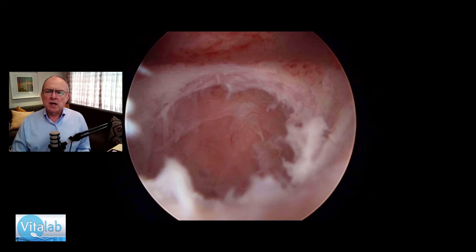you can see how quickly the cavity closes due to the myometrial contractions once the fibroid has been removed.